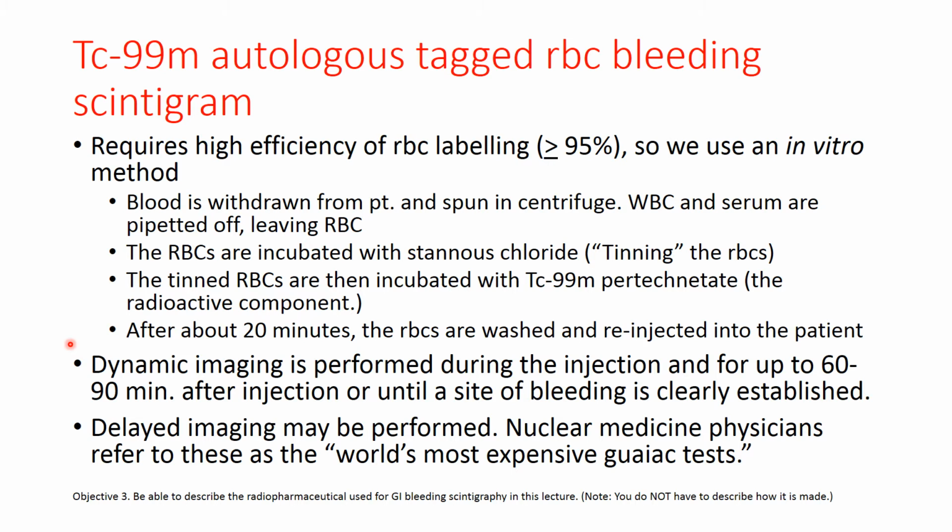By 90 minutes, everybody's tired of it. The patient's tired of it. We're tired of it. It's not very high yield, so we usually send the patient back if they don't have a bleed. If the patient has a brisk bleed, then we can terminate the study at any time.